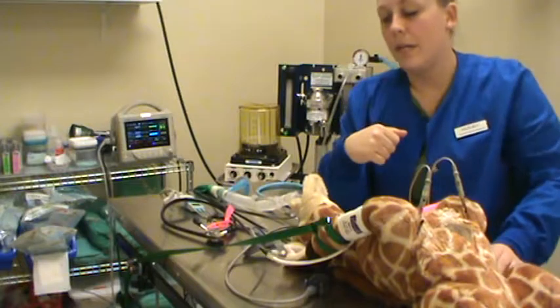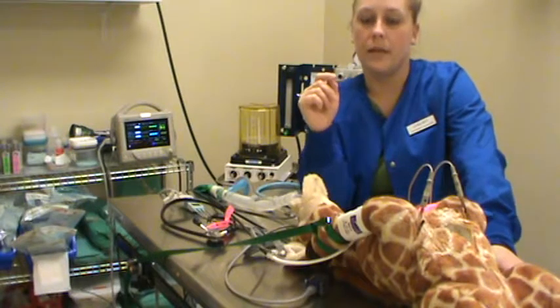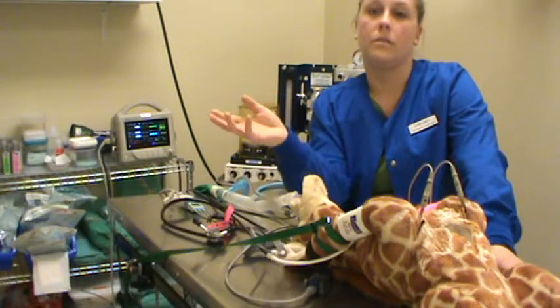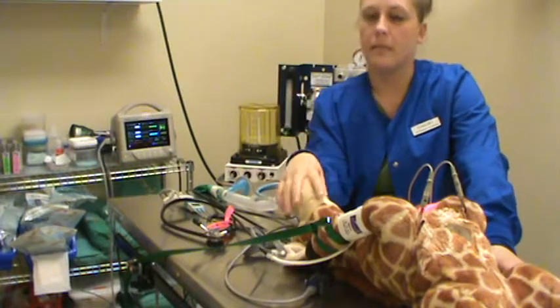So if you're seeing the heart rate get too low, you want to make sure, check your monitors, check your leads, make sure they're wet with alcohol because they become dry during the procedure. Check your patient, monitor other vital signs, and alert the doctor that you might think the patient is bradycardic or tachycardic, if that's the case.